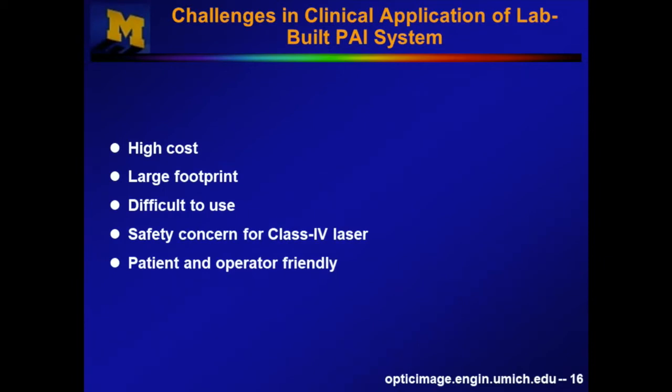We have to bring the patients to our lab to scan them. And also the system is difficult to use. We have to train the rheumatologist and the radiologist how to take care of the lasers, how to warm up the lasers before they can start to scan the patients. Of course, the safety concerns of class 4 lasers are also a problem.